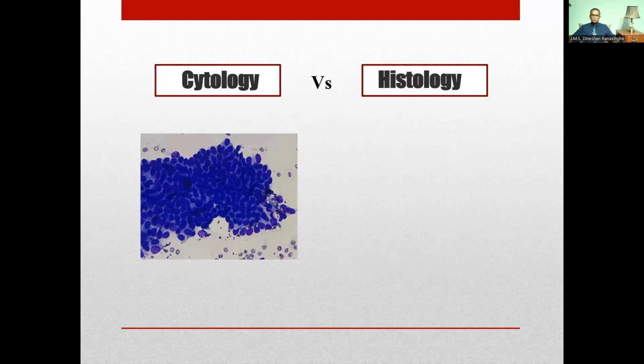It can be peritoneal aspiration. It can be cytology which comes from FNACs, fine needle aspiration cytologies, or it can be bronchial washing, bronchial brushing, or any sort of cytology or cells, body fluids you send us for cytological examination.